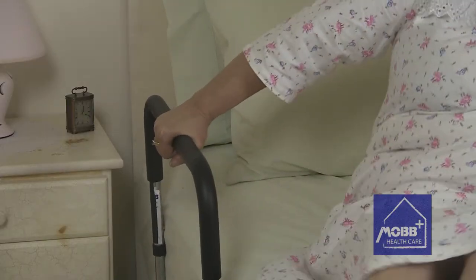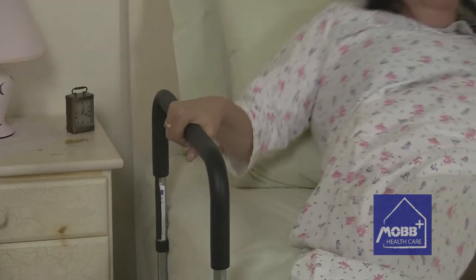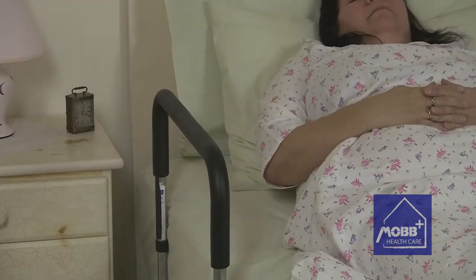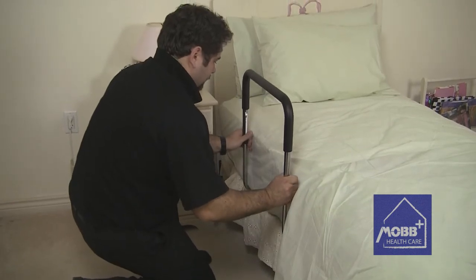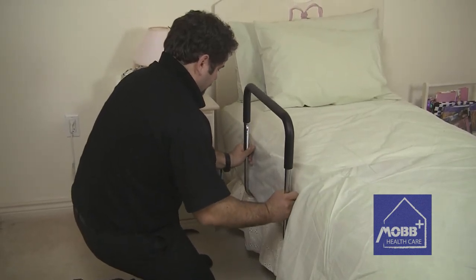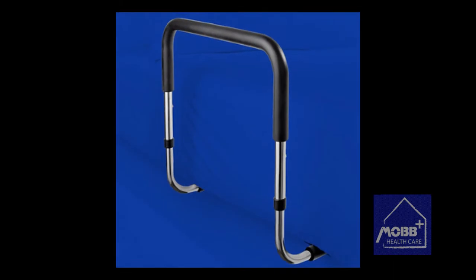The comfortable anti-slip grip on the railing handle provides additional safety for the Bed Assist Rail. The Bed Assist Rail is also height-adjustable, to ensure both safety and comfort for the user. The Bed Assist Rail supports up to 250 pounds.